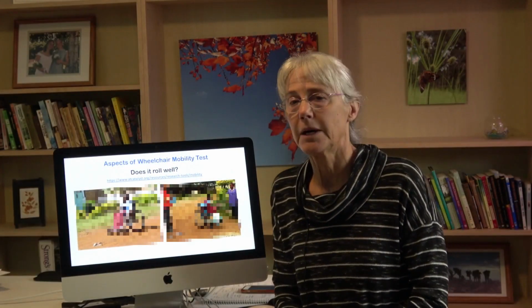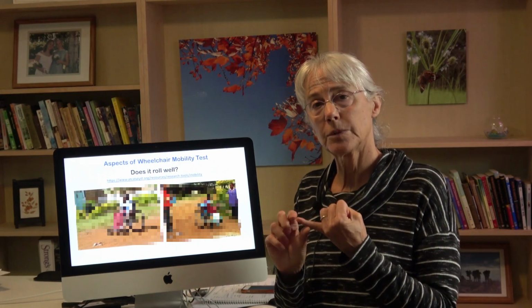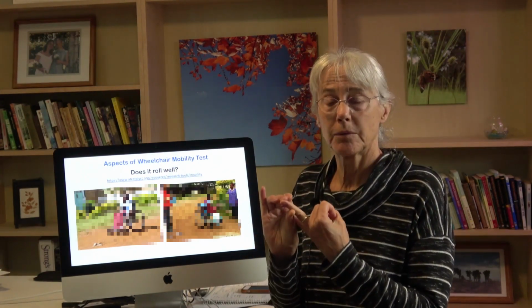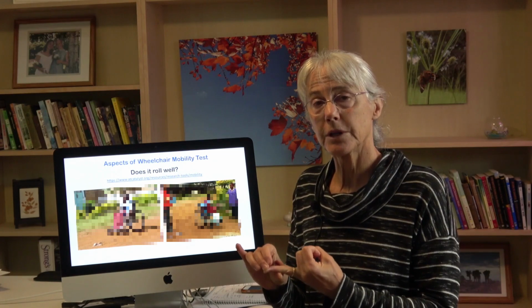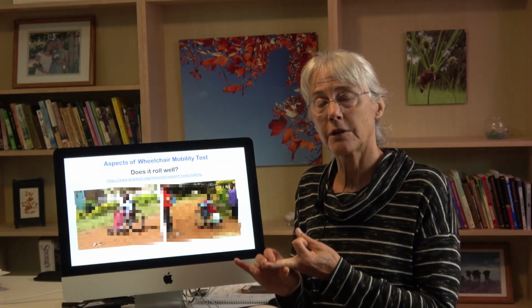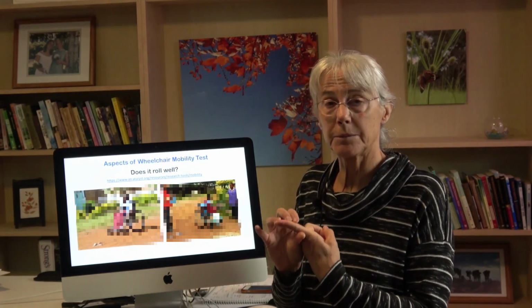I'd like to tell you about the aspects of wheelchair mobility test. We've looked at some other measures. We looked at the wheelchair components questionnaire, which answers, is it broken? The wheelchair interface questionnaire, which gives a wheelchair professional a voice to say if it's appropriate for the user. The wheelchair satisfaction questionnaire, which gives the wheelchair user a voice to say are they satisfied with it. And now we want to ask if it actually rolls in common environments of use.